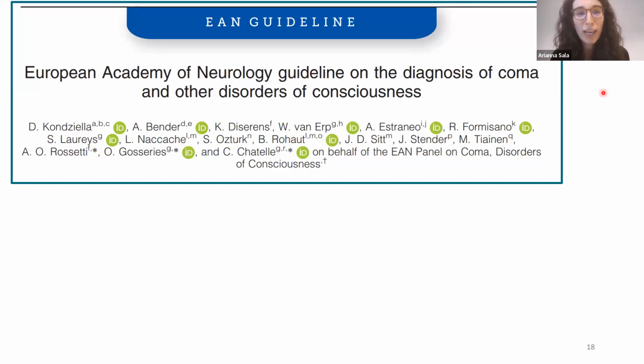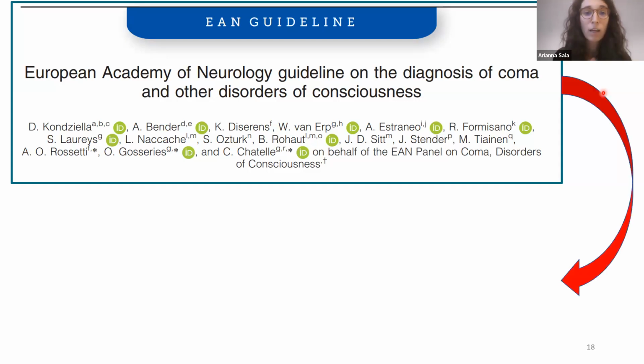So there is quite some evidence that PET is useful in disorders of consciousness, and all this evidence and more has resulted in the most recent guidelines on diagnosis of disorders of consciousness now recommending the use of FDG-PET for the differential diagnosis of disorders of consciousness. Based on 5 studies and almost 400 observations, they show that there is a 95% sensitivity and 70% specificity in distinguishing between unresponsive and minimally conscious patients based on FDG-PET.